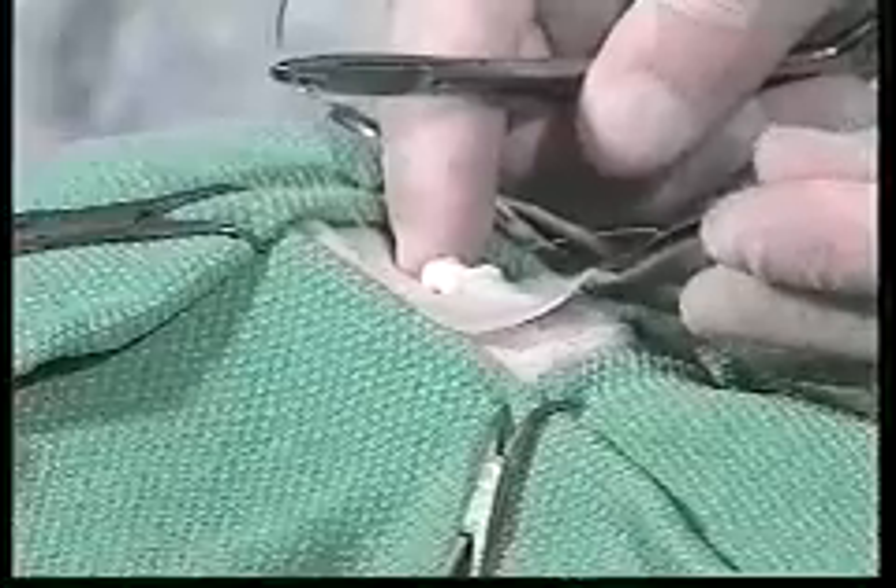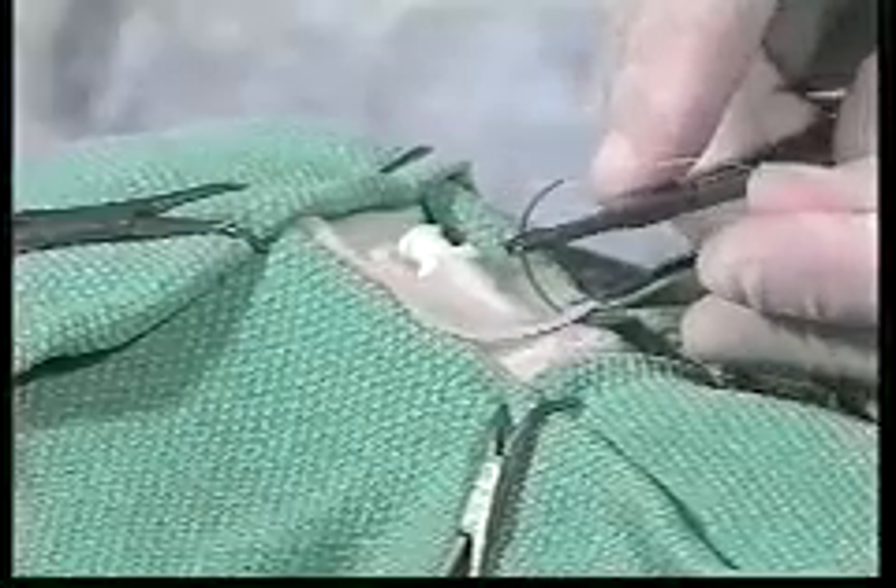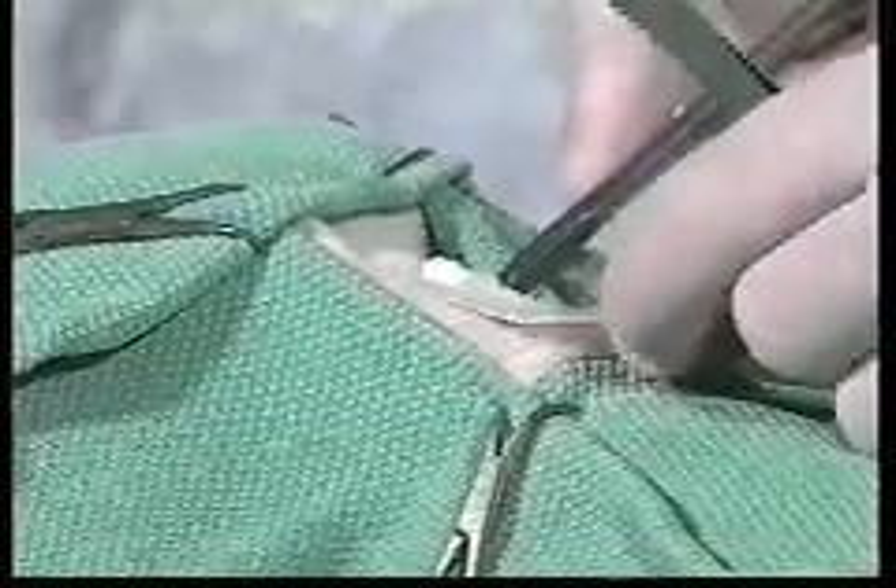It is important to begin the suturing at the 5 and 7 o'clock position on the tube — that way the tube is not going to start to slide out as you are tying your other sutures. I like to get about a quarter-inch bite in the skirt of the tube, then reach under and get just about the same bite underneath the skin. When we tie these sutures, we just want to lay that skirt against the skin; we don't want to pull it tight where the suture is going to tend to cut in.